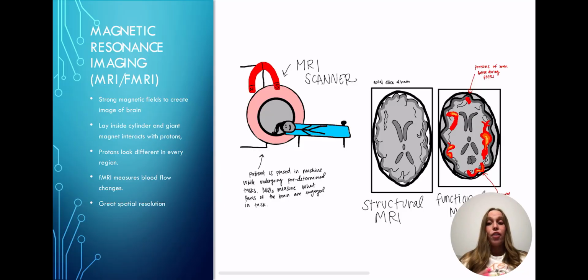Both MRI and fMRI are very accurate when it comes to spatial resolution. They show a very distinct photo and have millimeter kind of accuracy in their depictions. But their weakness is temporal resolution. Even in fMRIs, the timing of the brain response is delayed.